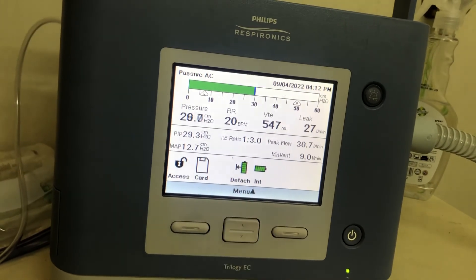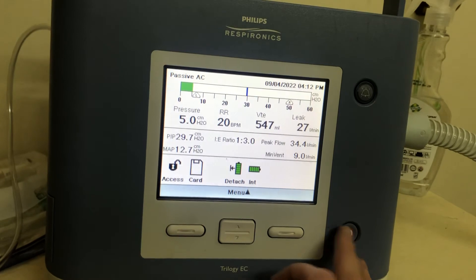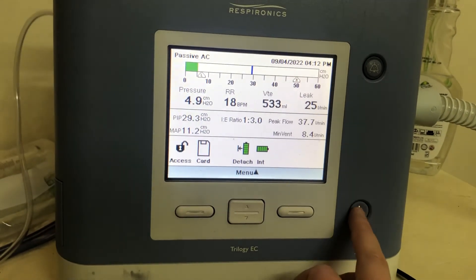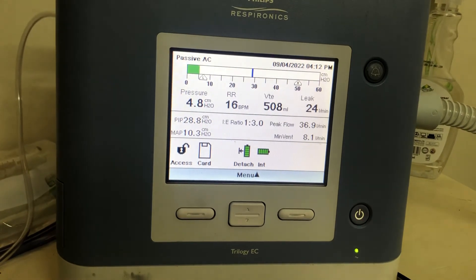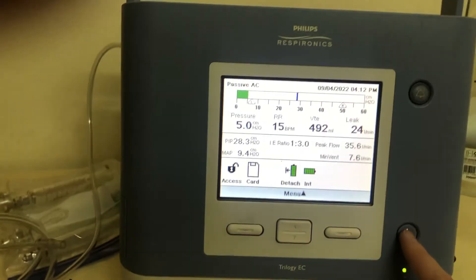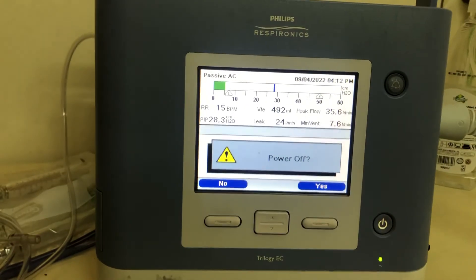We've got an internal and a detachable internal battery, so it gives us a fair amount of time. If both are full, going to CT or similar should not be a problem. When you're done with the machine, the tubings just need to be cleaned in the Cidex, and you power off by just hitting the power-off button.